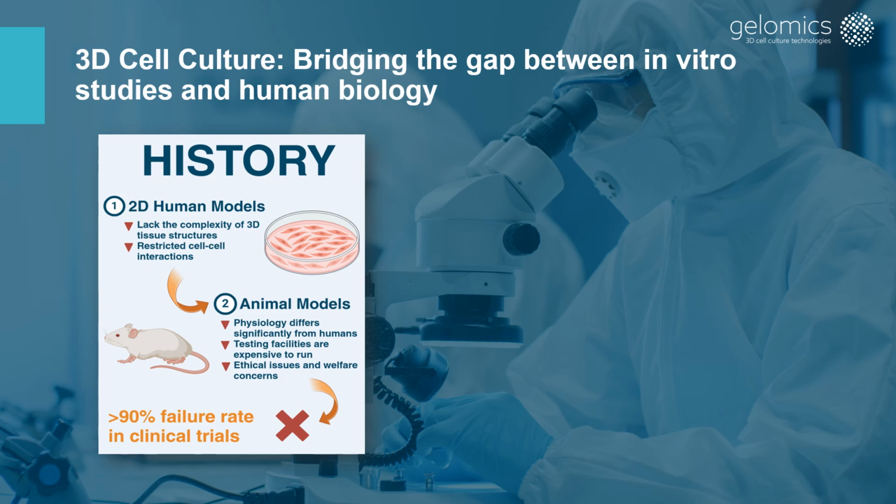As we all know, the historic workflow for disease modeling and preclinical drug discovery has been 2D cell culture assays followed by animal models. Unfortunately, the results for this approach speak for themselves.